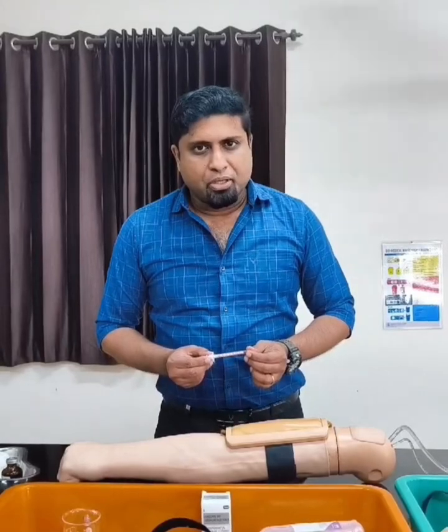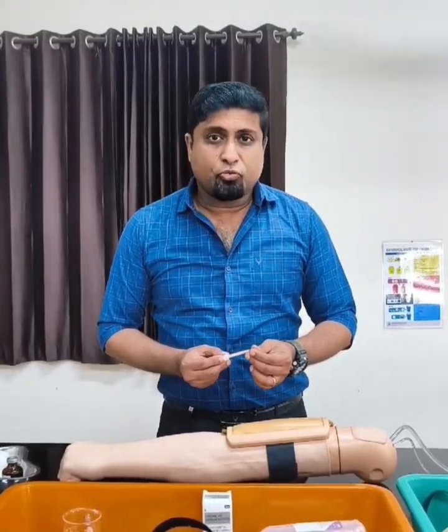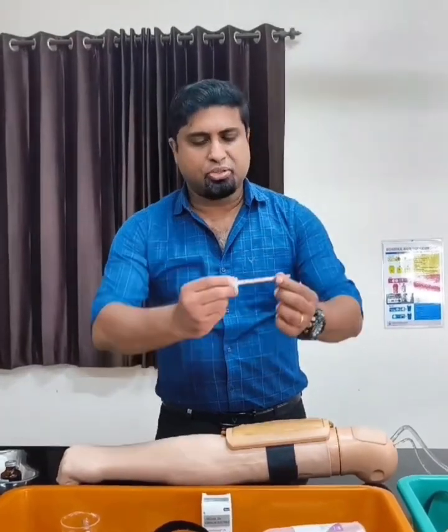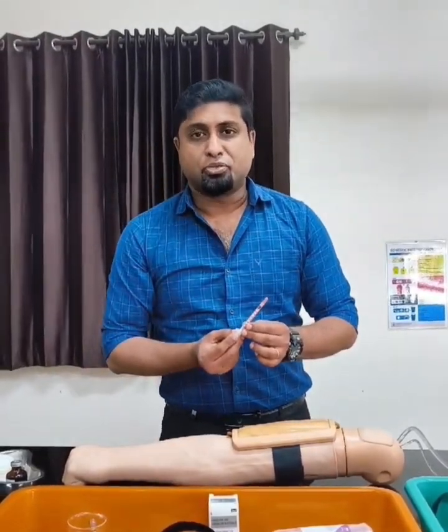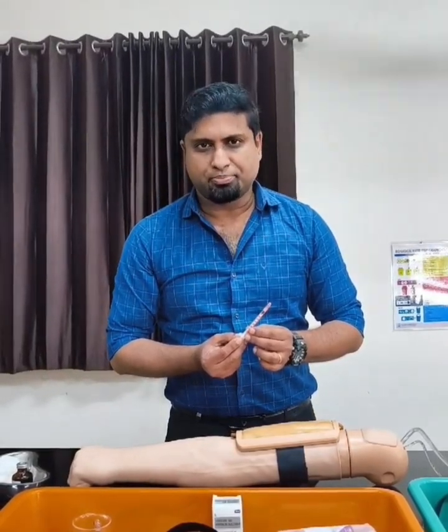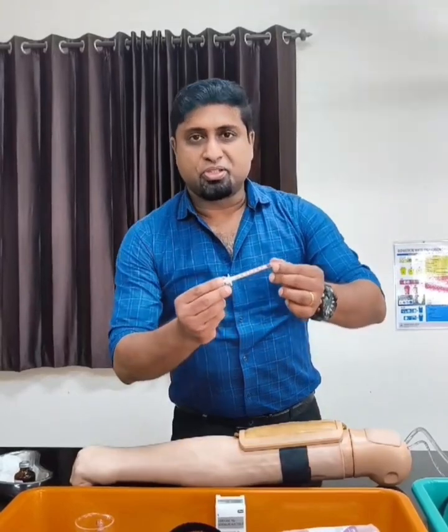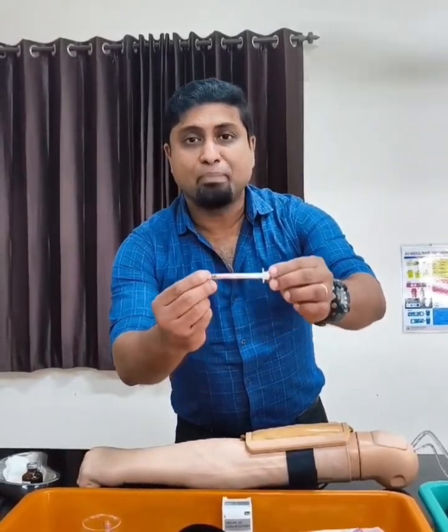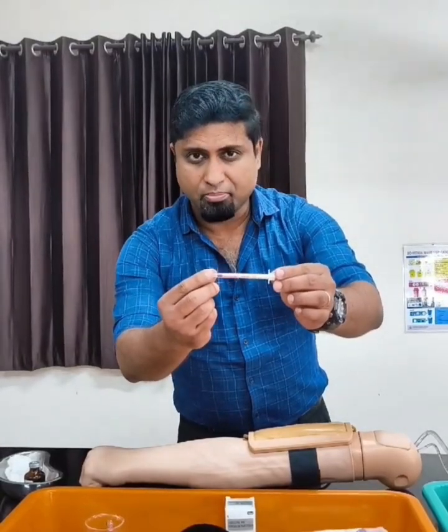For example, if you want to administer U40 insulin, then you should be selecting a U40 syringe. Now, this is an example of an insulin syringe which has been specially designed to administer U40 insulin. I don't know if you can see, but if you take a look at this syringe, you will see that it is a 1 ml syringe. The capacity is 1 milliliter.